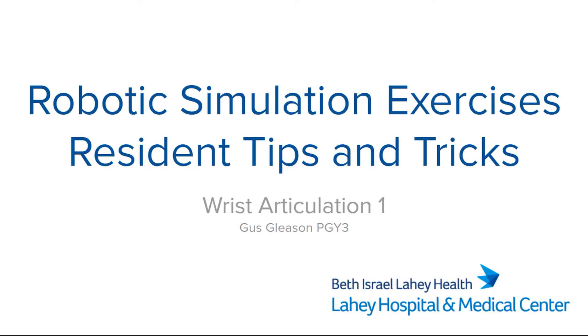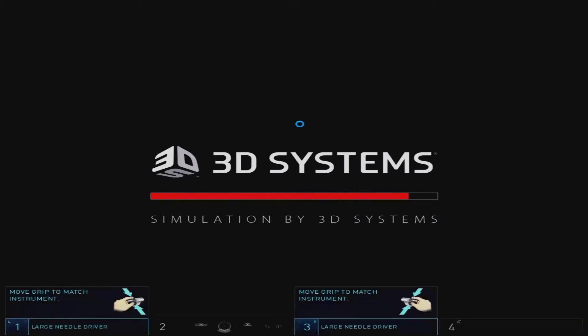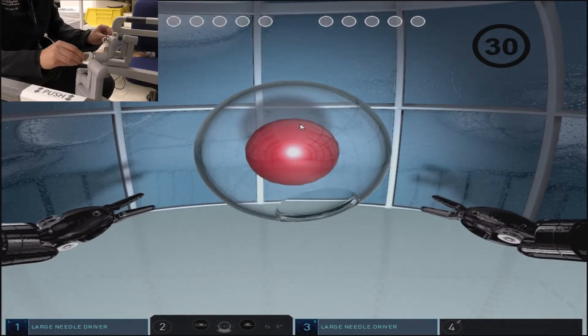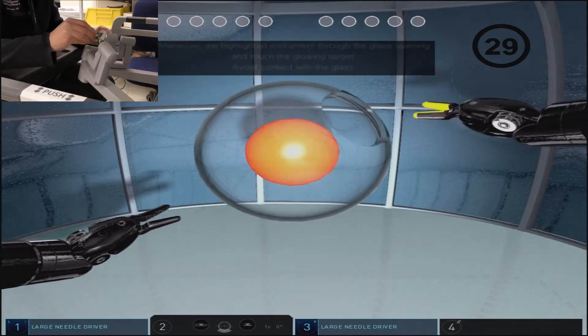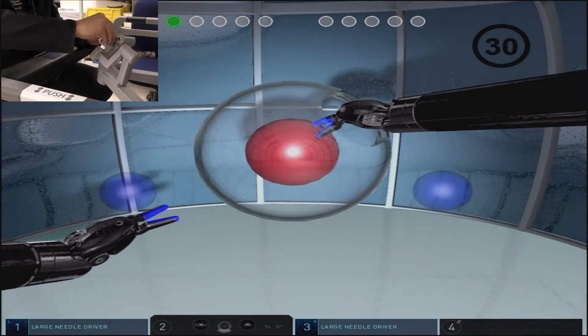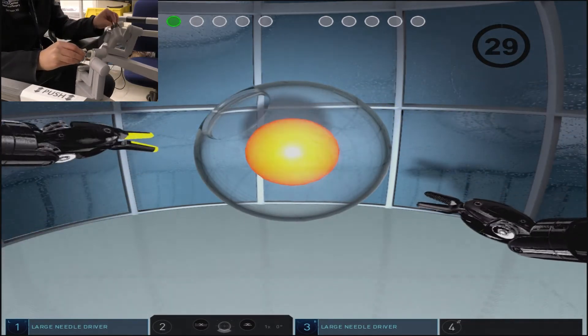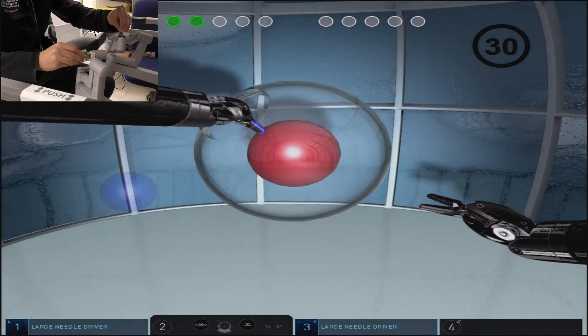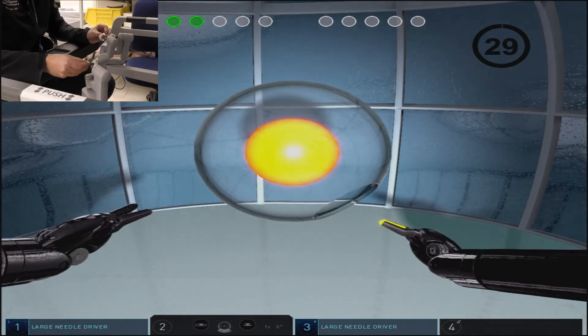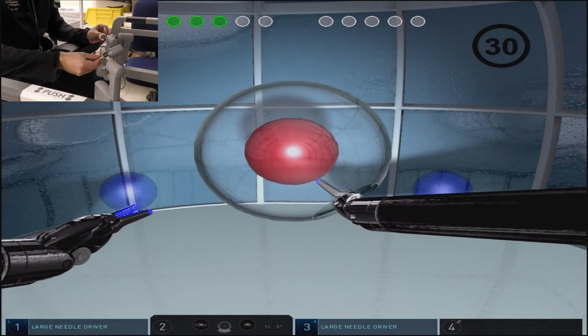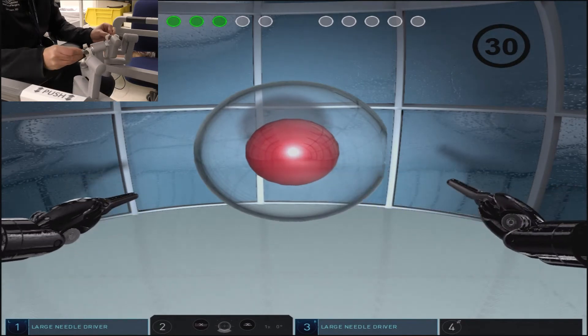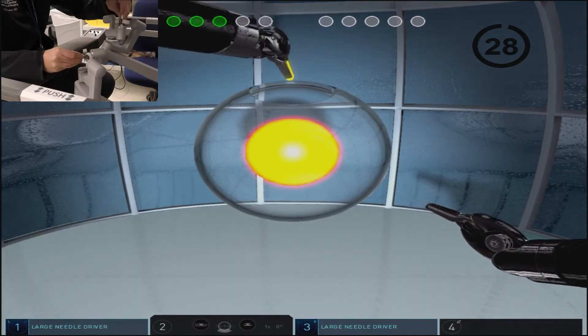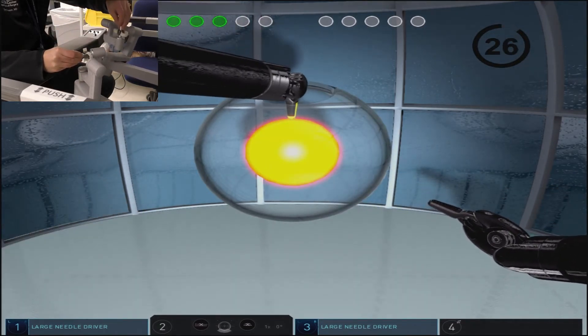The wrist articulation exercises are designed to provide understanding and comfort with the wrist articulation hand controls. Wrist articulation 1 is simplified so the user is solely focused on figuring out the best way to articulate the controls in order to touch the sphere inside the glass globe without coming in contact with it.